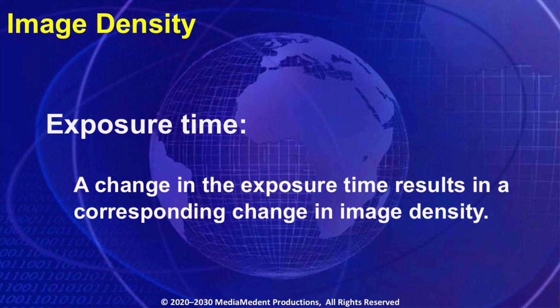This is because a change in exposure time results in a corresponding change in X-ray quantity and image density. That is to say, if the exposure time were to be doubled, the radiographic image would be twice as dark. Likewise, if the exposure time were decreased by 1/2, image density would be half as dark.